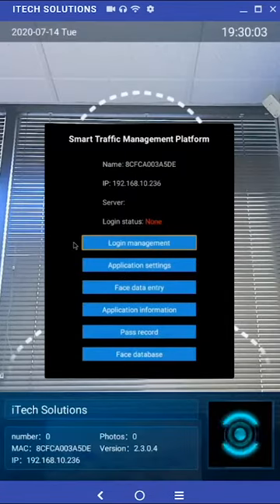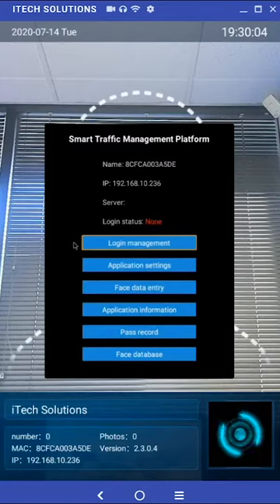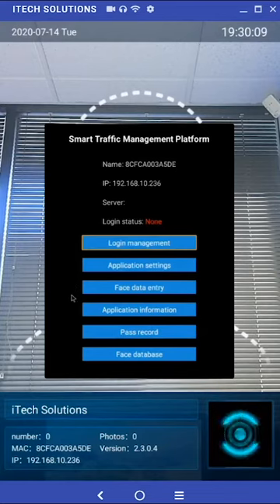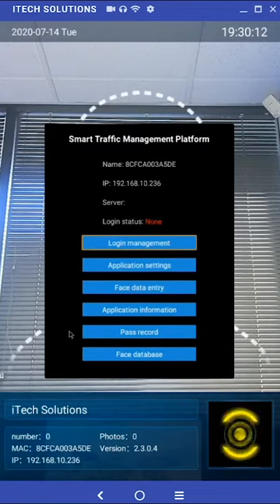This brings up a submenu with the following options: login management, application settings, face data entry, application information, pass record, and face database.